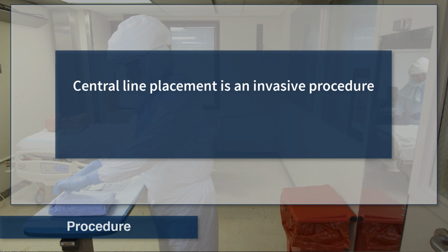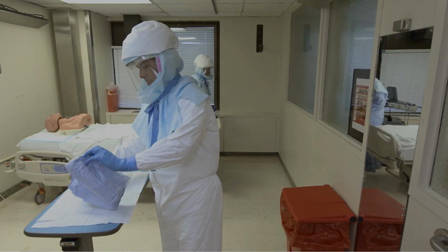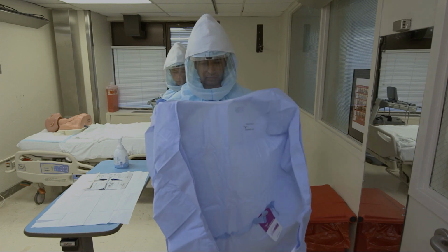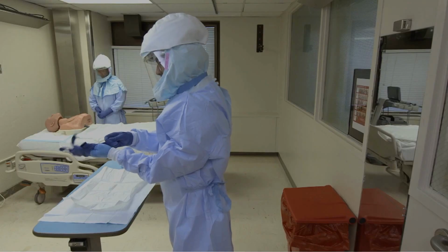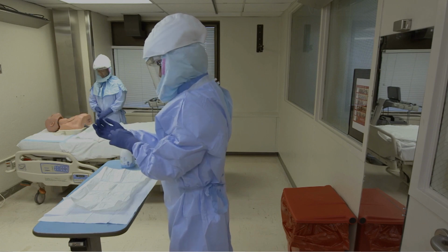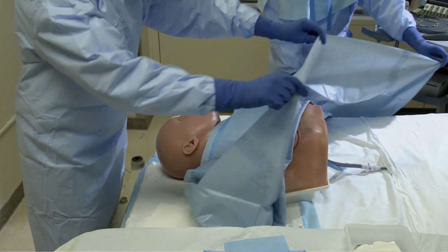Because central line placement is an invasive procedure, sterile PPE should be worn over the top of the routine biocontainment PPE for the protection of the healthcare worker. If the institutional protocol includes wearing a disposable apron or gown over a coverall, it is reasonable to consider replacing the outer garment and the external layer of gloves with new, sterile ones. Donning these new sterile items should take place at the bedside. As with any central line insertion, sterile technique should be observed throughout the procedure.